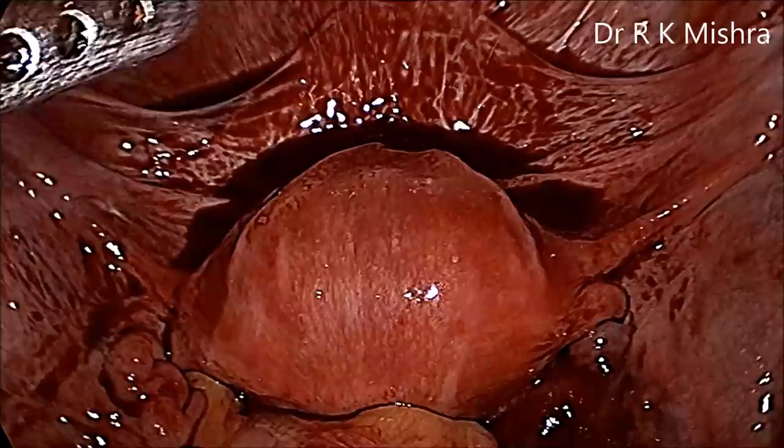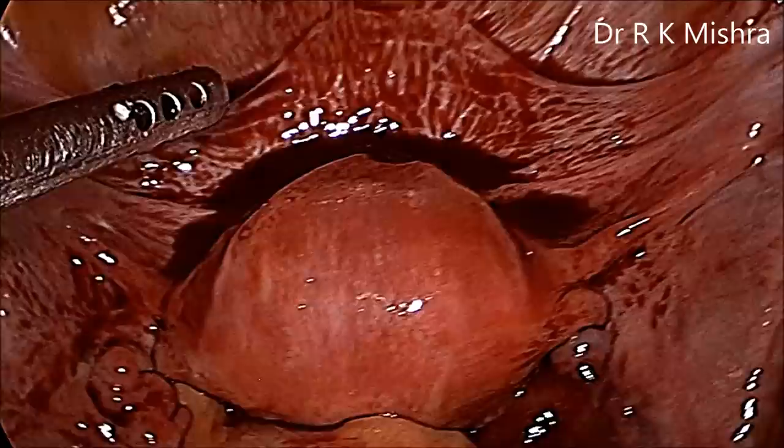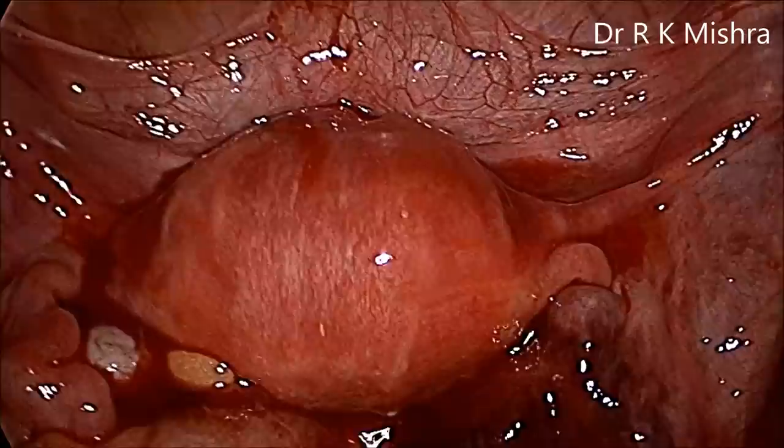We will do thorough lavage of the upper abdomen later, but right now the pelvic blood has to be diluted and sucked out to achieve better vision. The shaking movement of the uterus will start dissolving the clots, and the blood collected from the cul-de-sac has to be taken out.